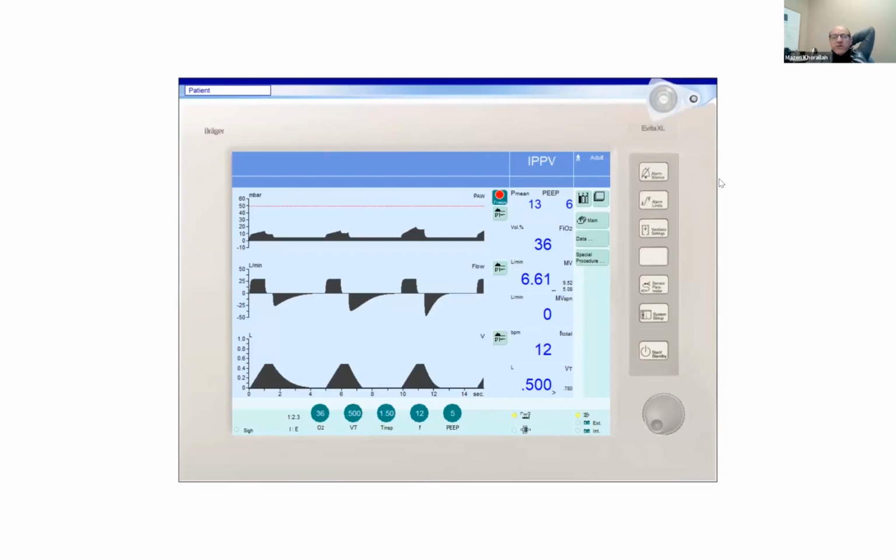The significance of driving pressure is that it's actually the most important pressure that you need to monitor on the ventilator. The driving pressure, again, is plateau pressure minus PEEP. You want this to be less than 18 centimeters of water. Better if it is less than 15 centimeters of water. This will cause less lung injury and it will provide safer mechanical ventilation on the injured lungs.